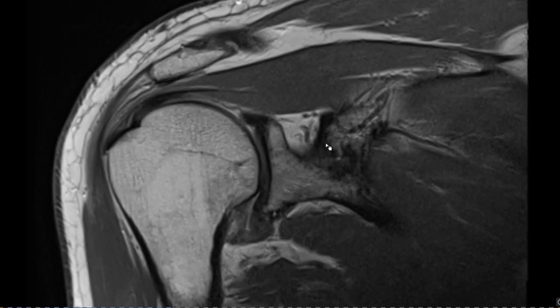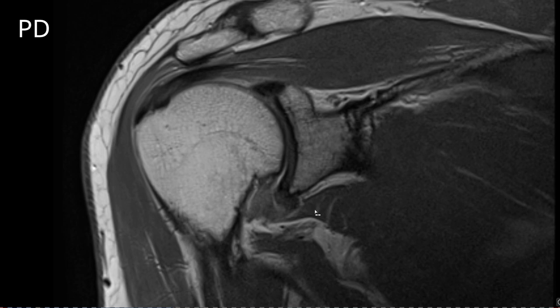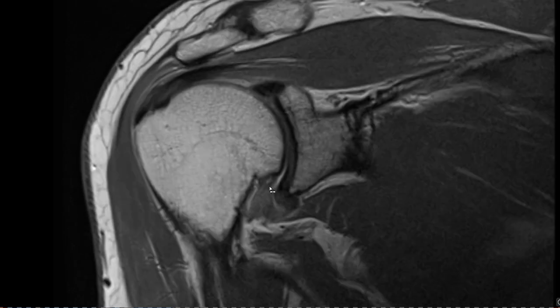Now let's compare this with a 70-year-old male patient. This time we have an indirect MR arthrography with PD without fat saturation, and you can immediately see how different the axillary pouch looks. It's thickened and hyper-intense in signal intensity — this is clearly abnormal.